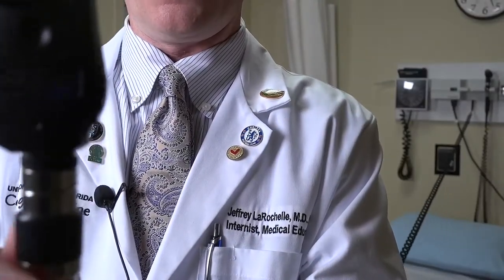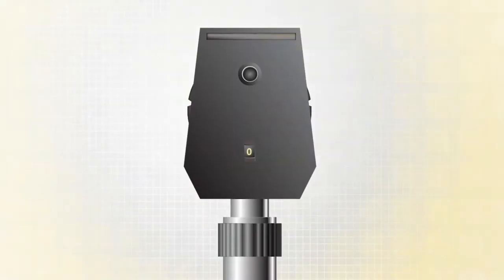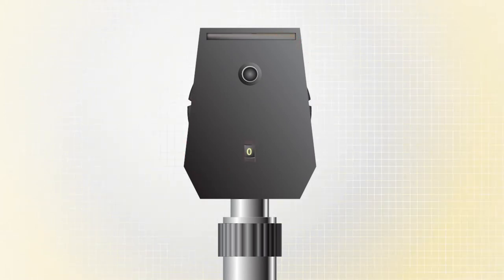On this side, it is on a white zero — that is basically home base. You can turn it into the red numbers one way — so that's a red one, red two. You can turn it back to white zero and then in the other direction into the green numbers. The red numbers are basically an infinite lens, so the focal length doesn't change once set. The green lenses are actually magnification lenses, and every time you change the green lens, it changes the focal length, and you'll have to change how far away you are for it to be in focus.